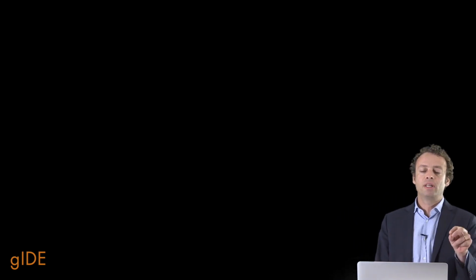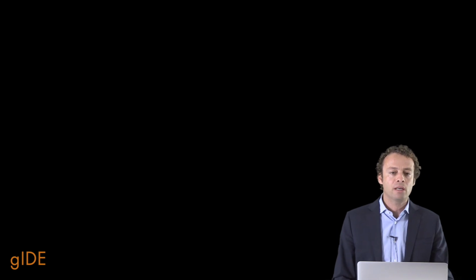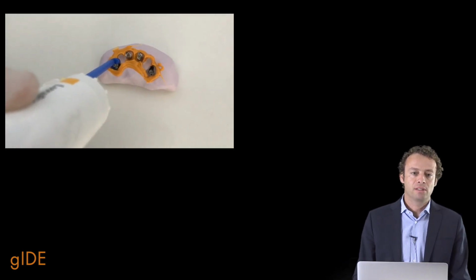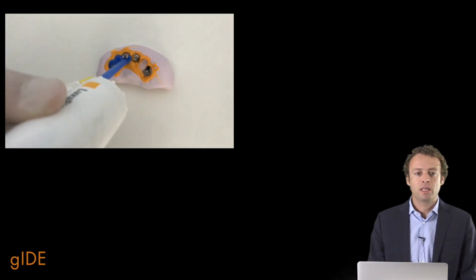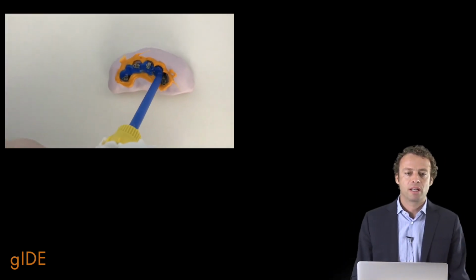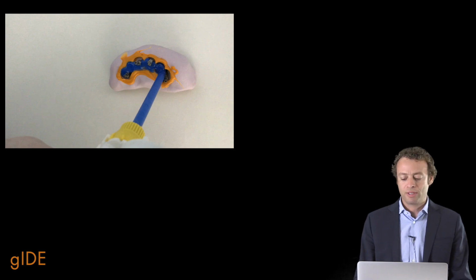And then we fill the gap that we have around the impression coping with the Luxabite. This is a new blue material. The setting time of this material is really smart because it's around 1 minute, 90 seconds, something like this. So we don't have to spend too much time waiting for the setting.